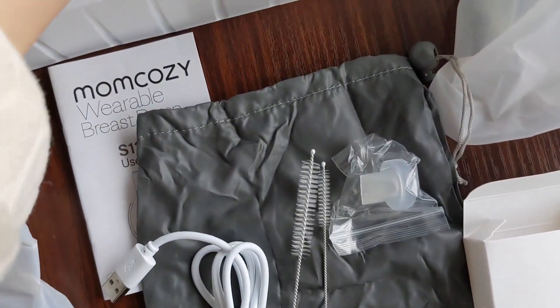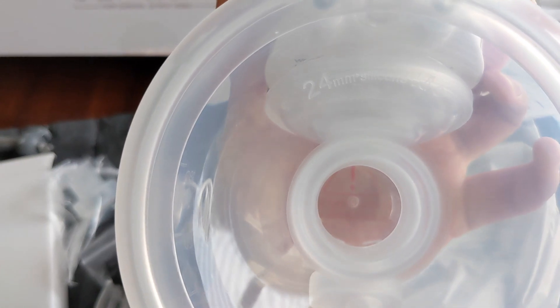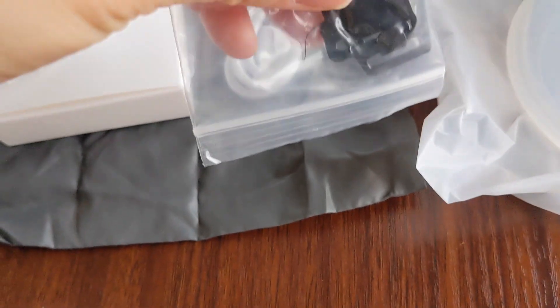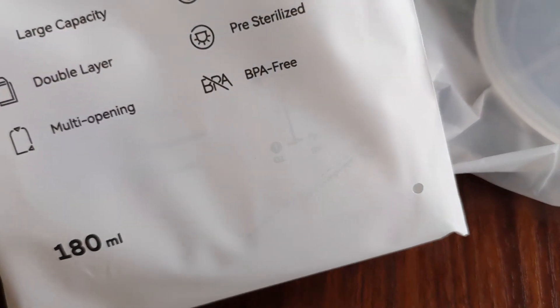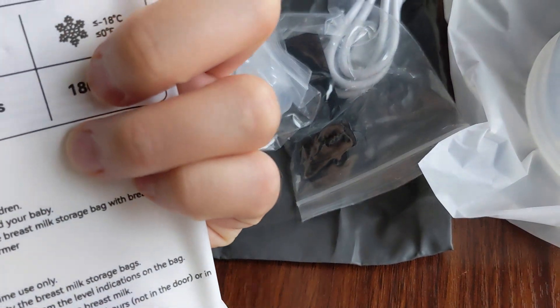So we have two of the actual pumps — it looks like they're the 24mm flange size. In this little box it comes with an additional valve, since there's already one on the pump, and this looks like the nursing bra clip. We also have the charging cable, a storage bag for your pump, and then six-ounce breast milk storage bags — I think there are eight of those.